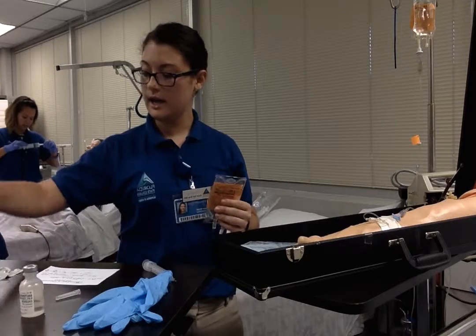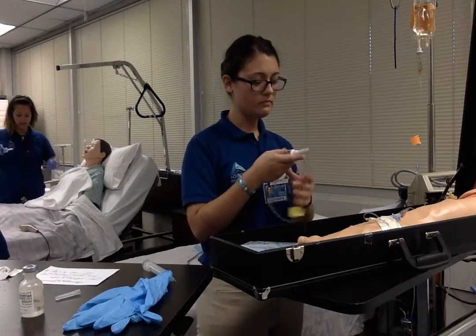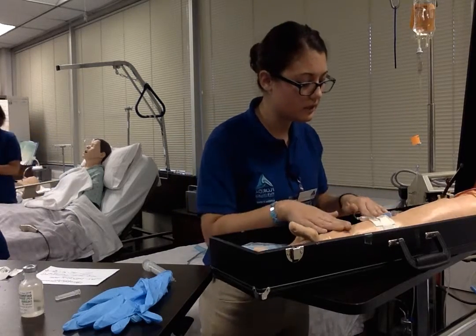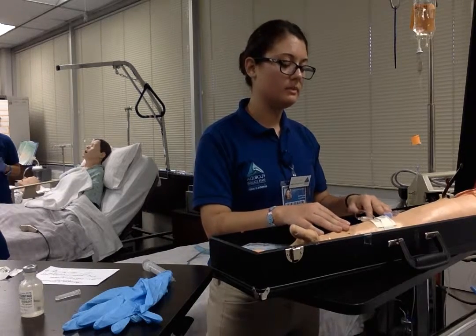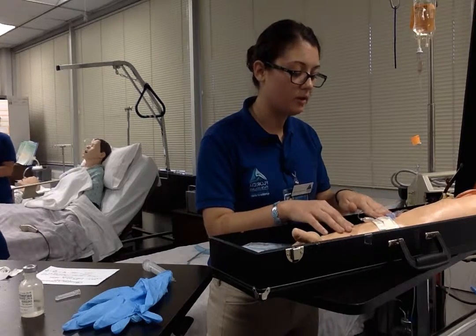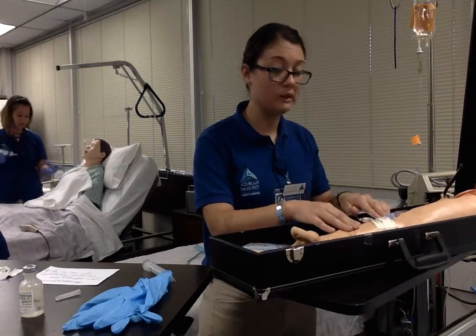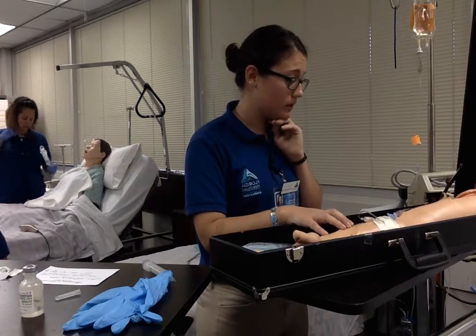I'm going to go ahead and I have that line that I showed you earlier that I prepped. Mr. Jones, how's that IV doing? Is it feeling any tenderness or anything? I'm going to go ahead and make sure I look at my IV site to make sure that it is still okay, that there's no blood under the Tegaderm, that there's no redness, swelling, or tenderness, anything like that, any swelling. And it looks pretty good, so that's great, Mr. Jones.